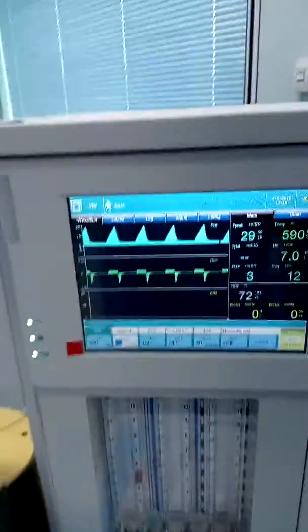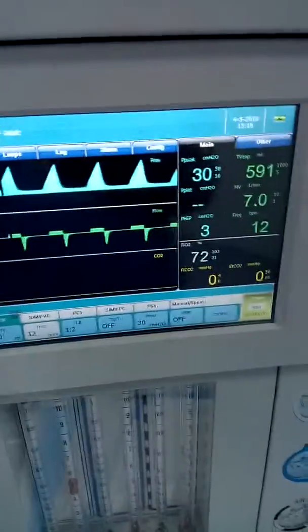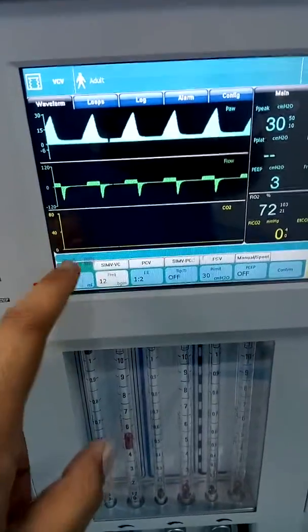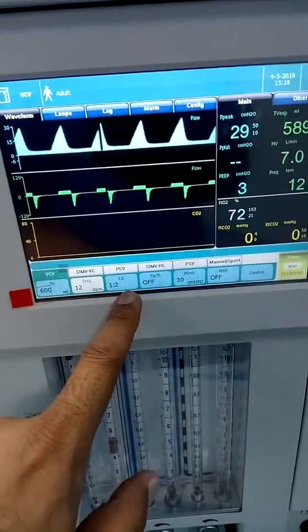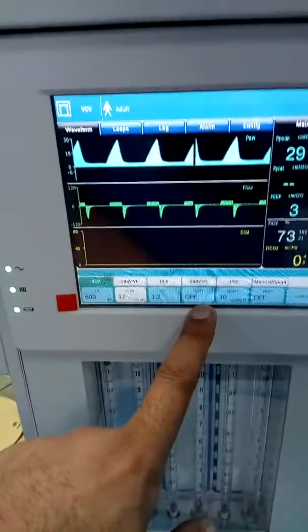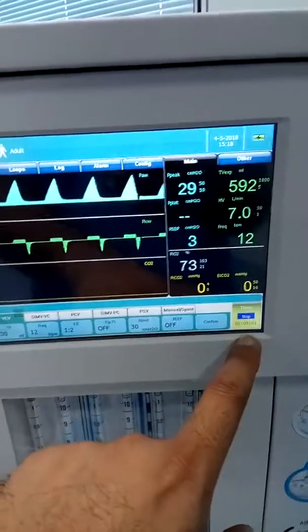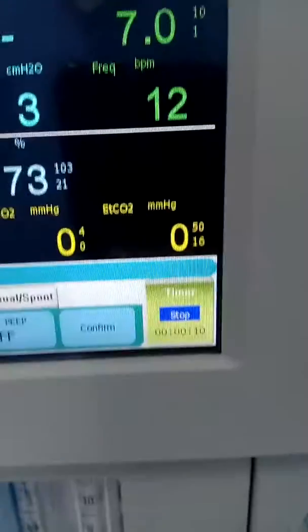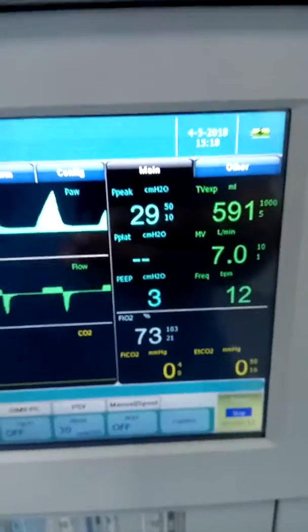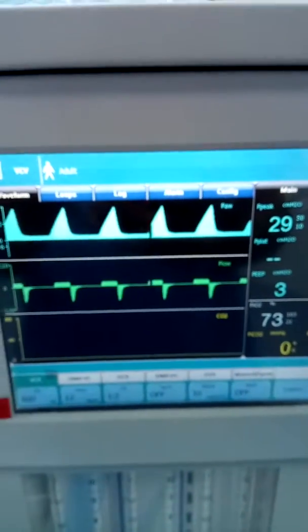Now let us look at the ventilator controls. Here is the tidal volume setting — the machine is working in volume control mode. You can see the I:E ratio, inspiratory and expiratory time, pressure limit, and PEEP. This is the timer — you can start it here. Timer means you can track the total case duration: how many hours the case has been going on. Here is the time and battery status, along with the patient time.